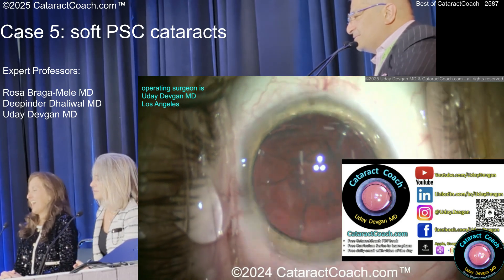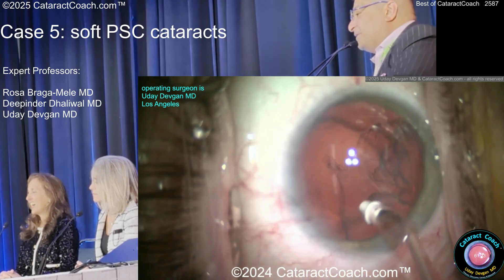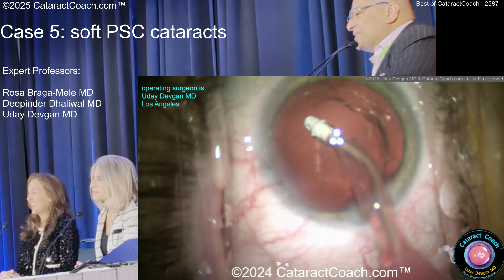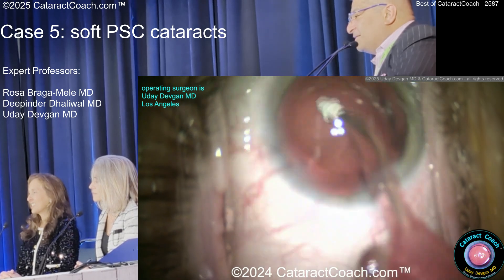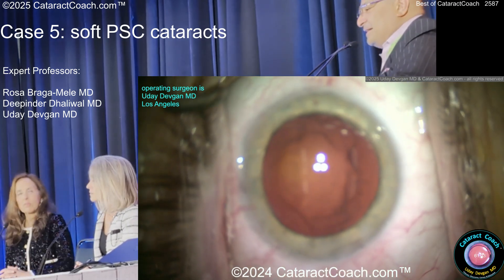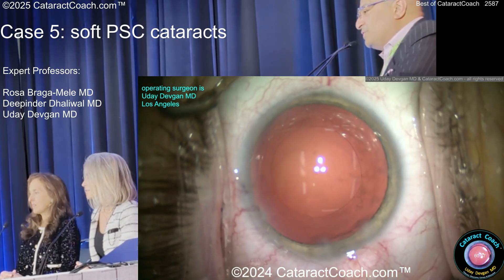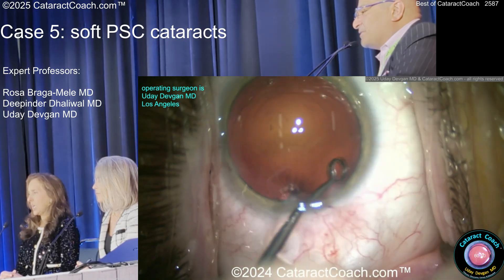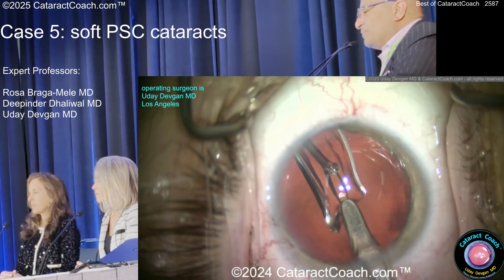We're ready for a commercial break here. Now I'm cleaning the cortex. The bag looks good enough to me. If it decenters later in life, I can always refer to Sanford — he'll figure it out. Now we're cleaning up here. In most of these PSC cases, you can get everything off the bag. The question is how aggressive can you be to clean up that posterior capsule? Looks pretty good. Put the viscoelastic in, get the lens in. How much polishing are you going to do on the posterior capsule? Is this enough or should you really clean it up? A little bit of polishing on the anterior rim. I'm just going to get the lens in and call it a day. Visual axis is clear.